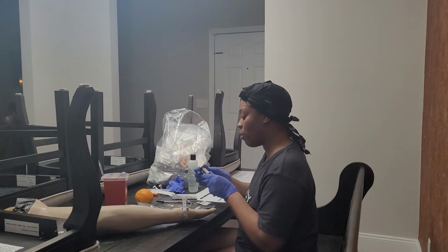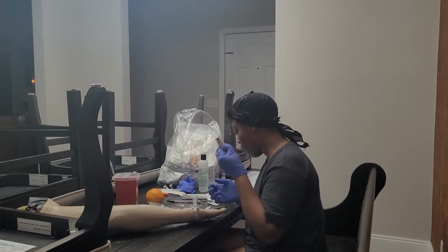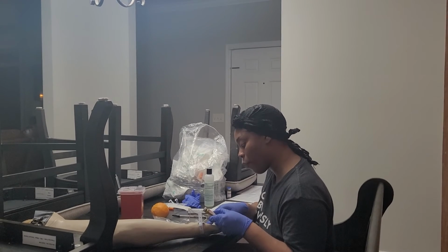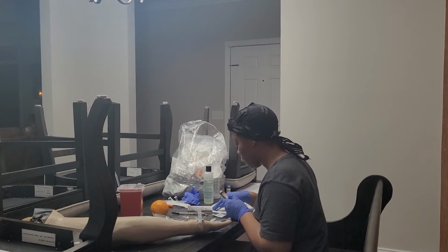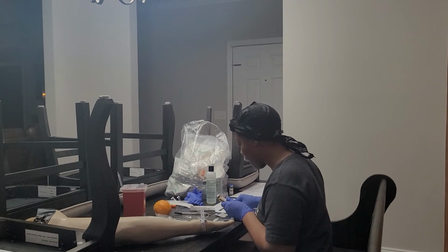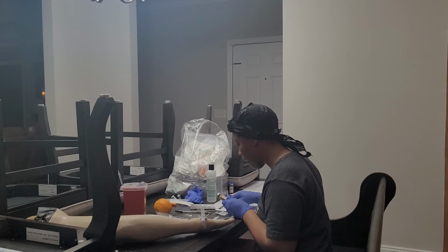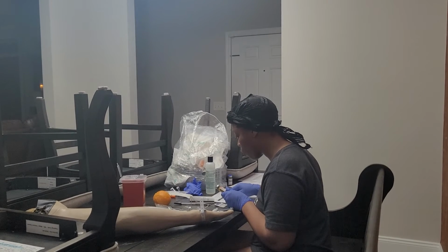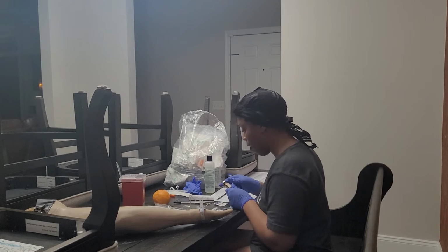I am right now double checking my medication, furosemide, on the vial. Double checking Millie Larson, date of birth 1/1/1936. Double checking my medication record, Millie Larson, date of birth 1/1/1936. Everything matches. My order says furosemide, 20 milligrams IV push every 12 hours, administer over 2 minutes. Flush with 3 mLs before and after.